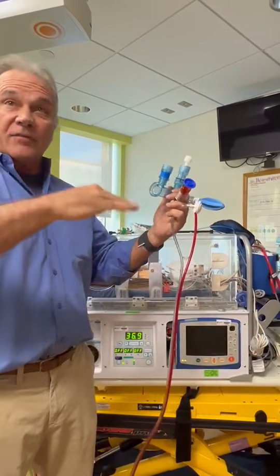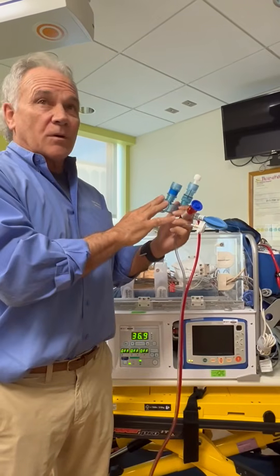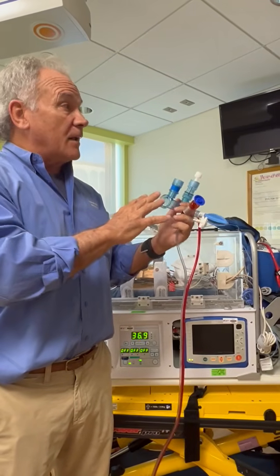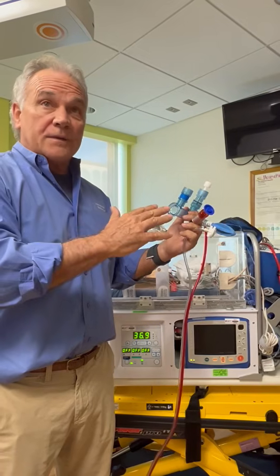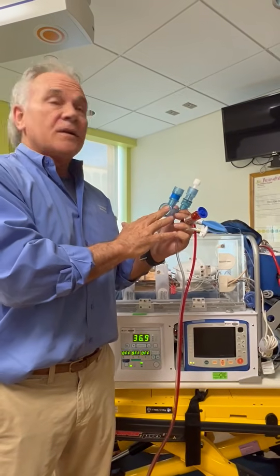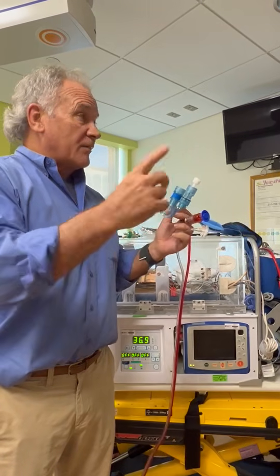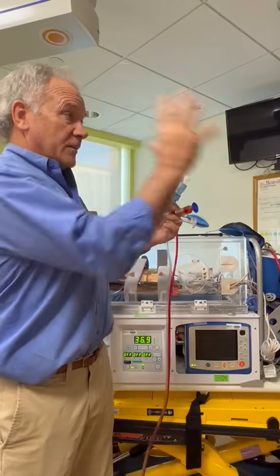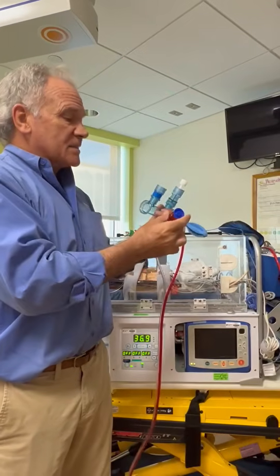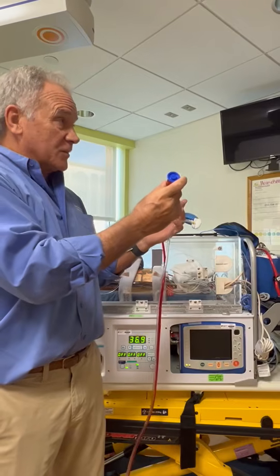You know, you piggyback off another vent to maintain PEEP, right? So it's more similar to the jet in that you'll run a lower rate, and then you've got to slow it down. And y'all know why you slow it down, right? To give time for exhalation. Okay. And so you have the jet and you have the oscillator. The oscillator delivers a breath, sucks it out. And I'm going to explain it with this analogy compared to the oscillator, just to give you an idea.